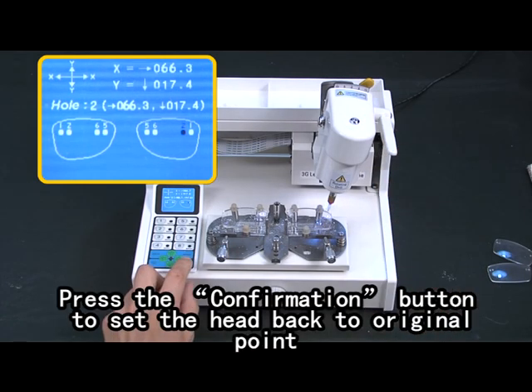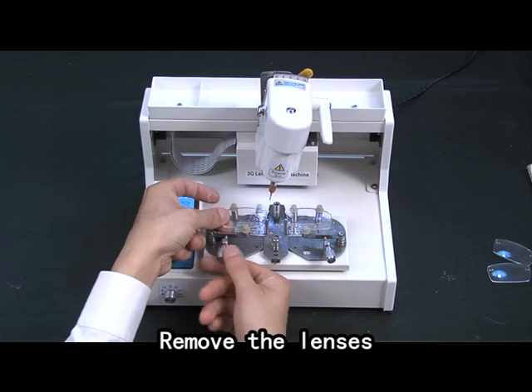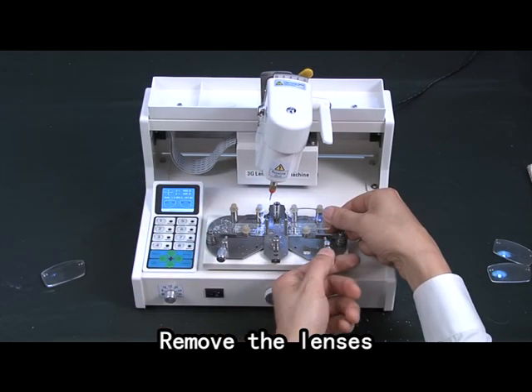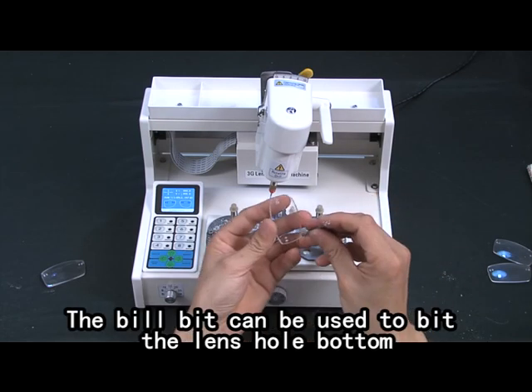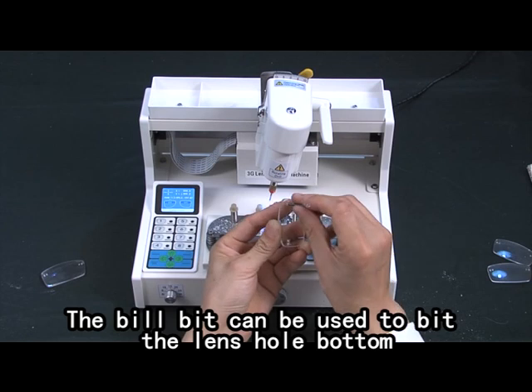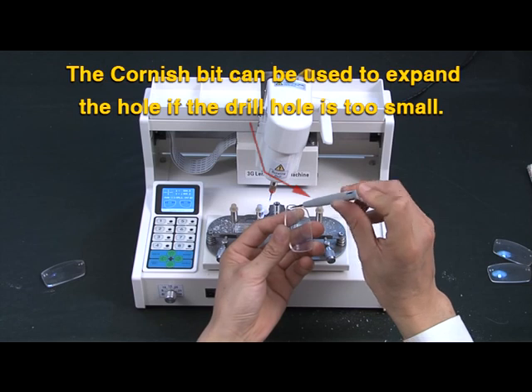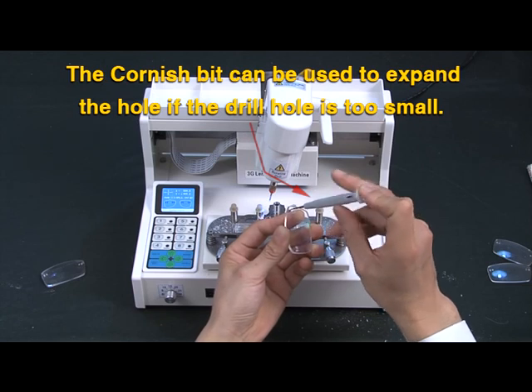Press the Confirmation button to set the head back to the original point. Remove the lenses. The drill bit can be used to smooth the lens hole. The countersink bit can be used to expand the hole if the drilled hole is too small.